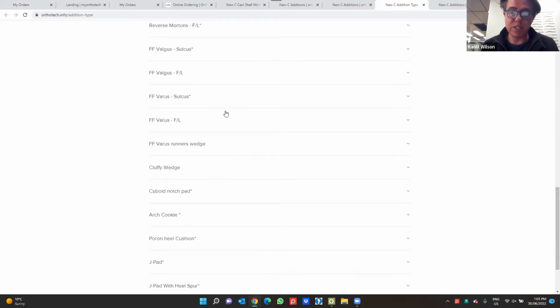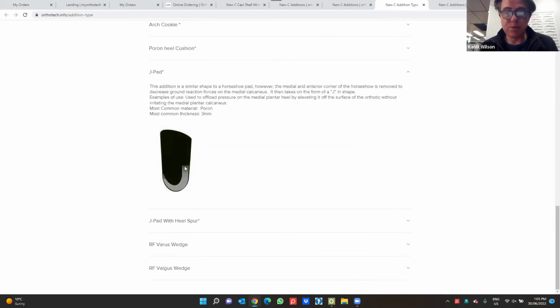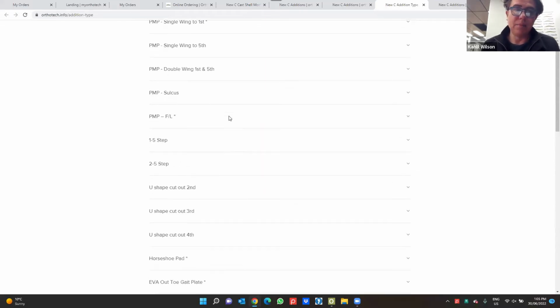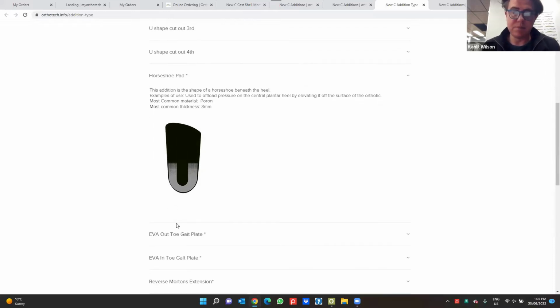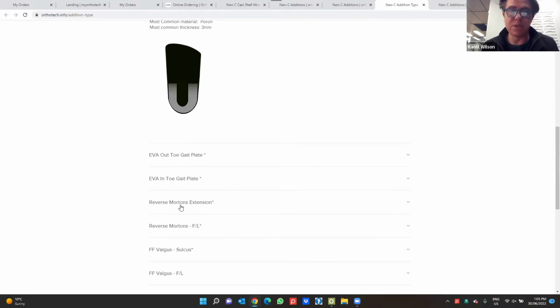But that's the reason why our J-pads also made the top 28, is that we've had this for a number of years, but it's only recently been added to the script. If you had medial insertional pain, then the horseshoe pad could irritate because you had a 3 or 4 mil drop off, and it was pressing into the heel spur or the tender area within the plantar fasciopathy.